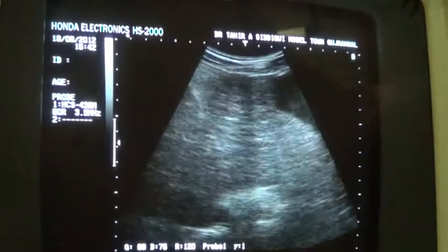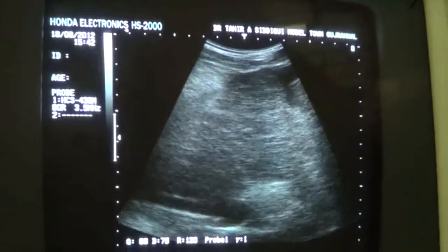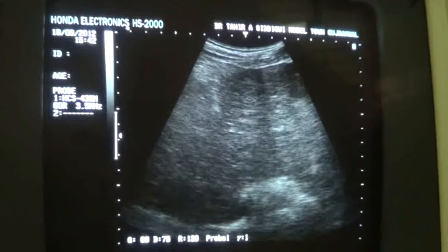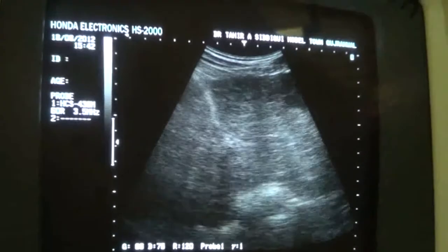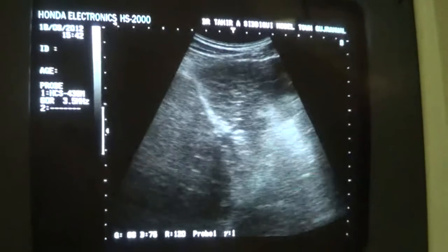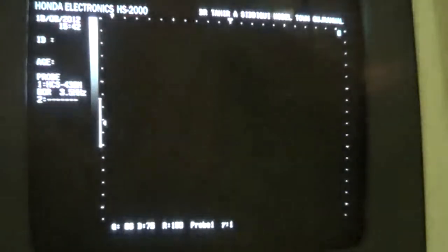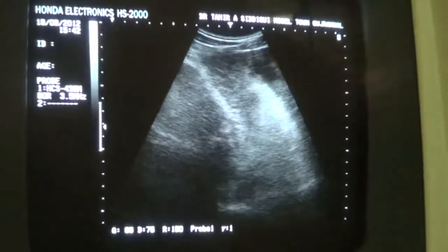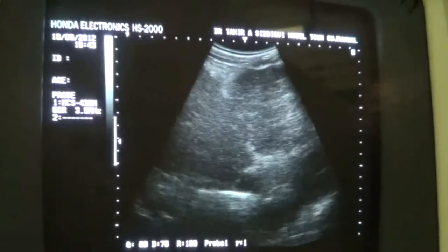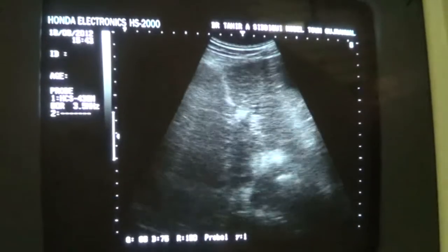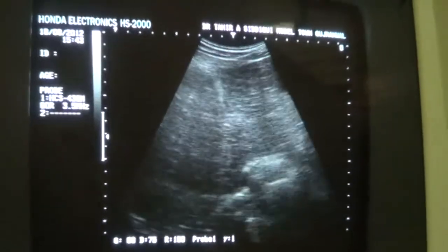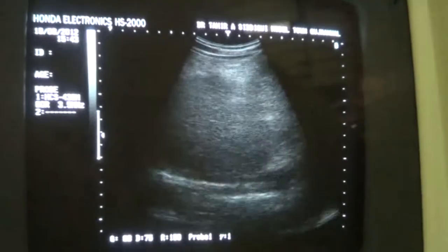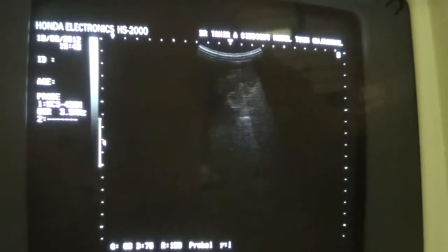Now this is the left lobe of the liver. I will try to show you both the right and left lobes, or otherwise we can do it separately.